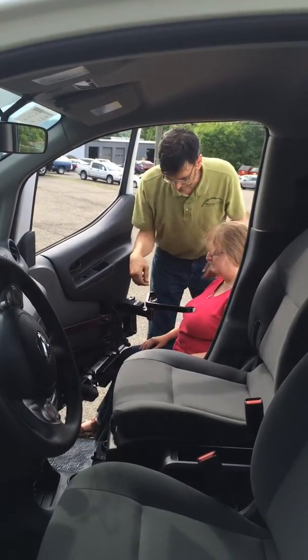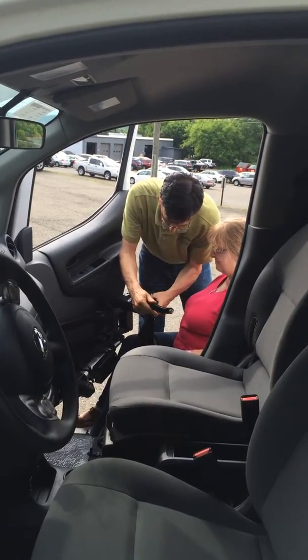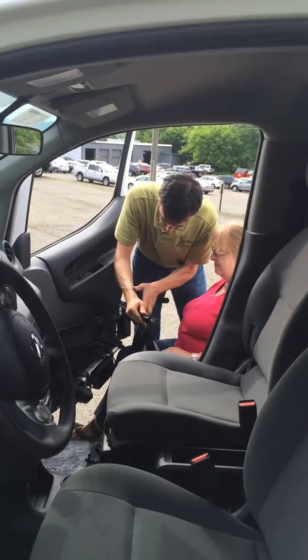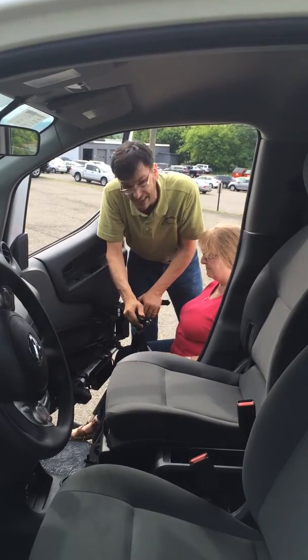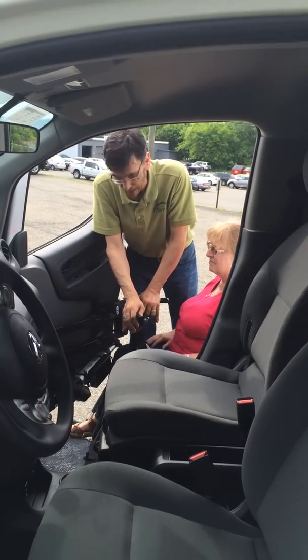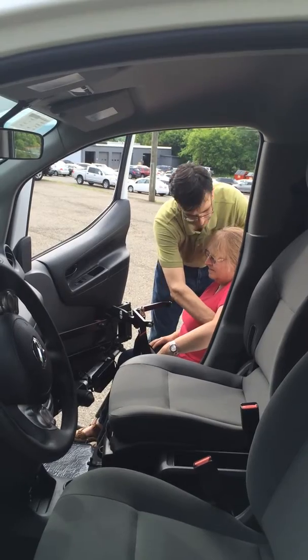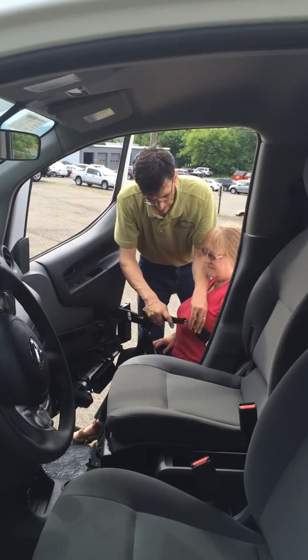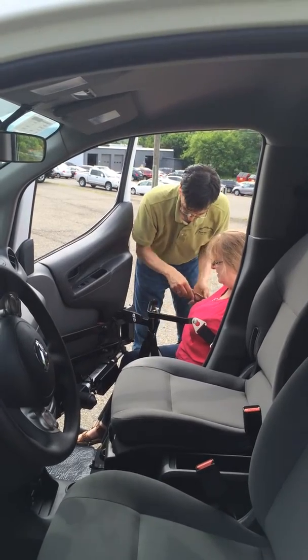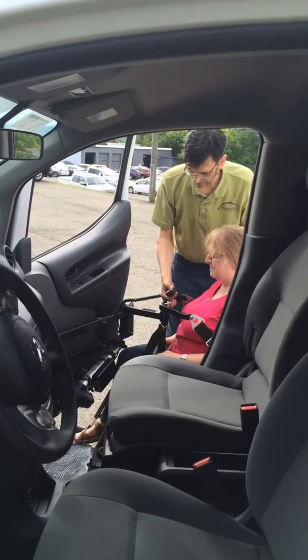Our next step is to put the user in place. We have lots of videos on our YouTube channel at youtube.com/accessun showing you the sling system. I will point out that this sling is put on after or before the person is transferred, without any lifting whatsoever. The sling goes around the person but not underneath. So next, we hook up the sling, and then we're ready to lift.